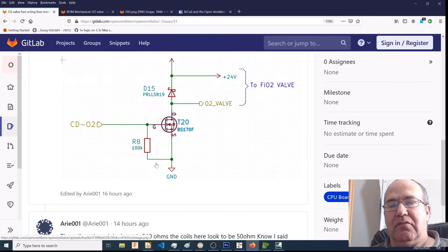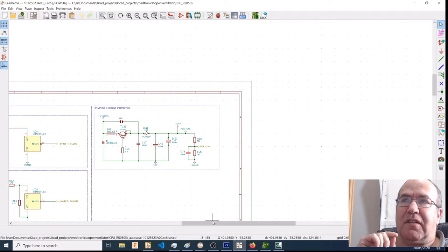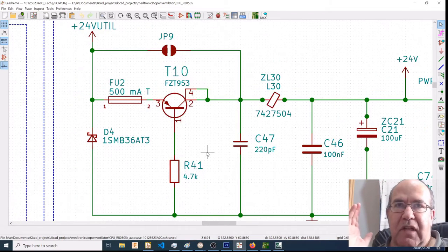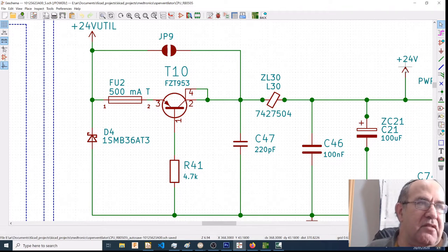The issue was raised via the lead person, Seth, on changing the fuse for the O2 replacement. I will now move to the position of the fuse in the circuit diagram. There is a 500 milliamp fuse in the circuit, and if your valve is going to take off the 24 volt line, it's going to take 500 milliamps. You're going to blow your fuse because you have other circuitry also on the line. So he was talking about increasing this fuse F2.